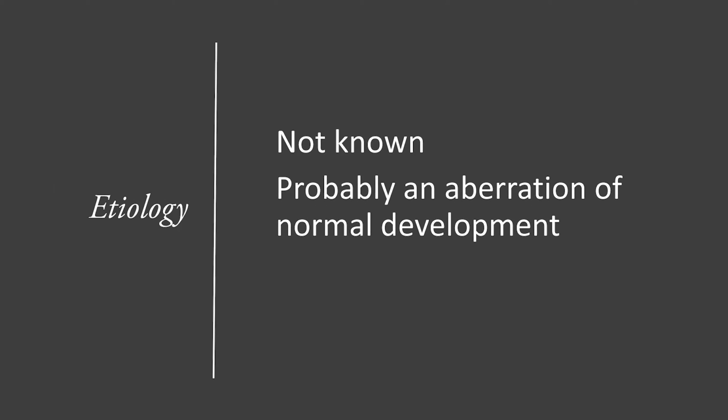As we just mentioned, the etiology is unknown. The current assumption is that it's a variation of normal development; there is no evidence of relationship with trauma. Therefore, the name traumatic bone cyst is a misnomer in two ways. It is not related to trauma and it's not a cyst.